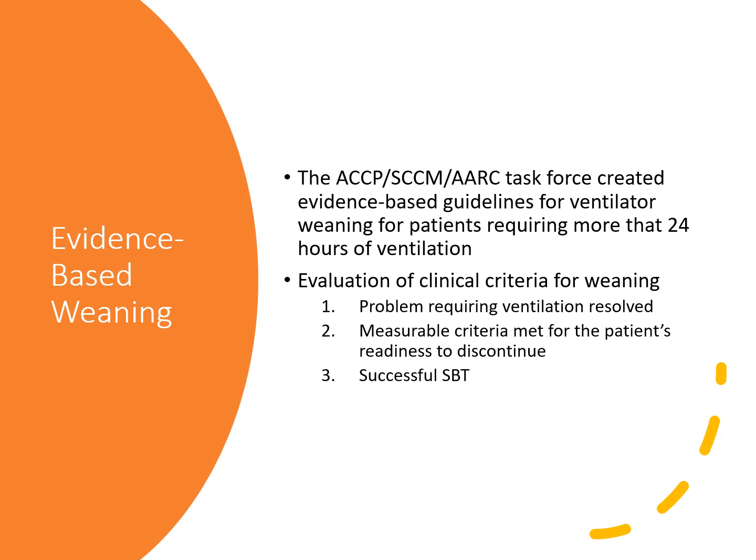One of the things that we look at is a literature review. The American College of Chest Physicians, the Society for Critical Care Medicine, and the American Association for Respiratory Care tried to create evidence-based guidelines for ventilator weaning, requiring more than 24 hours of mechanical ventilation. So these guidelines form the basis for much of the material in the remainder of the PowerPoint. So these are where these things are coming from that I'm about to speak about.